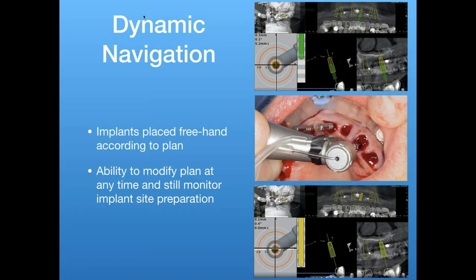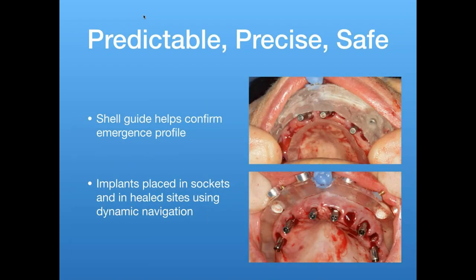We can then place our implants to plan using dynamic navigation. So the implants are placed freehand. And the big plus with cases like this is we have the ability to modify the plan at any time and still monitor the implant site preparation. So I quite often will change the position depending on what I'm seeing and feeling during surgery, but I'm still able to watch the pathway of the drill as I'm doing it.